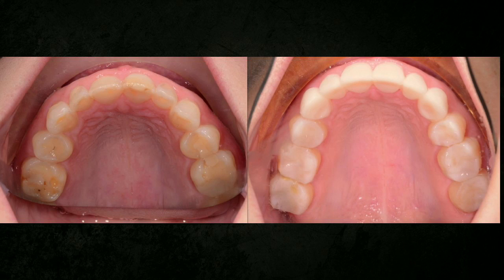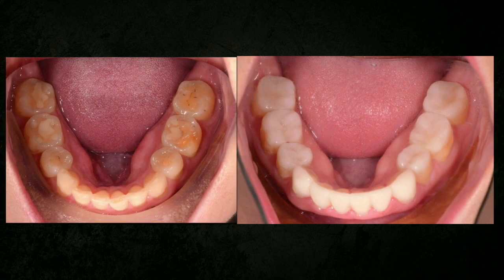Widzimy w odcinku przednim prace tymczasowe, wykonane onleje czy odbudowy kompozytowe w odcinku bocznym. So when we finished her with a material called Amber, which is a lithium disilicate. To są prace już docelowe, wykonane z materiału, który się nazywa Amber. Jest to materiał na bazie dwukrzemianu litu.